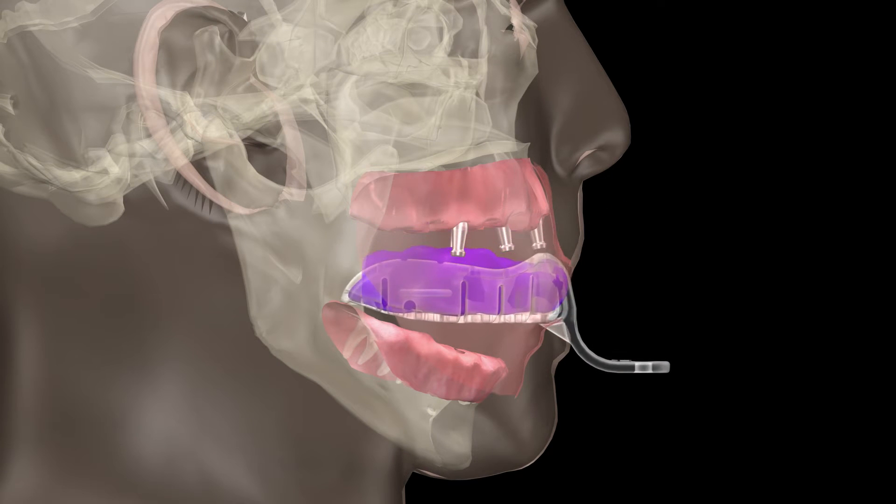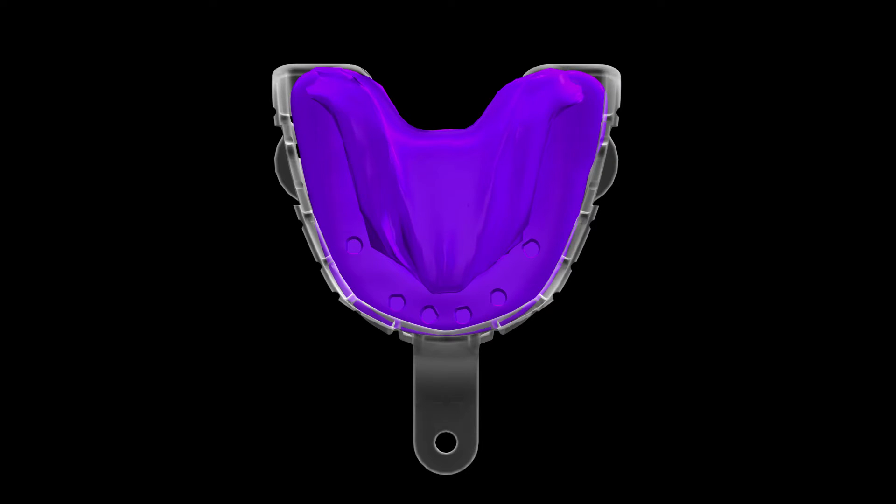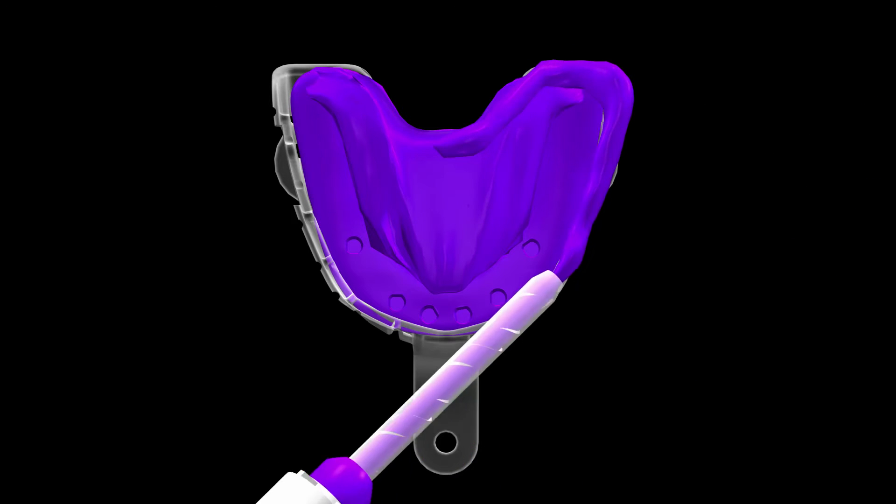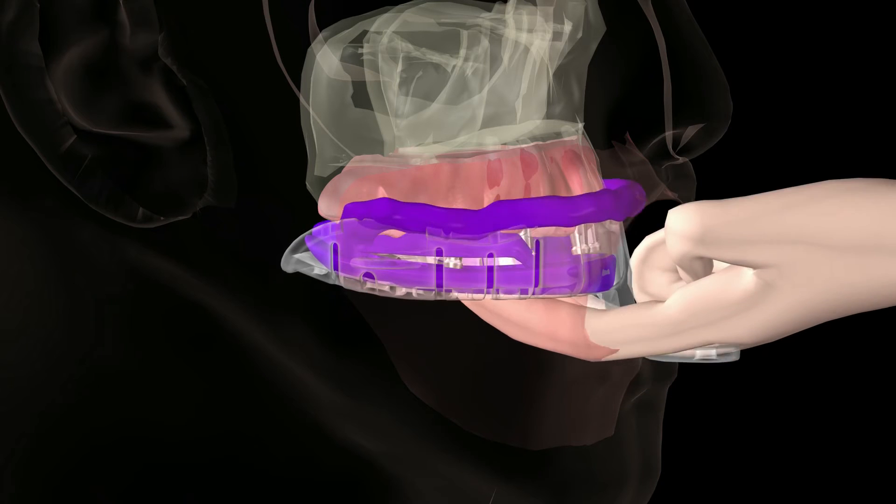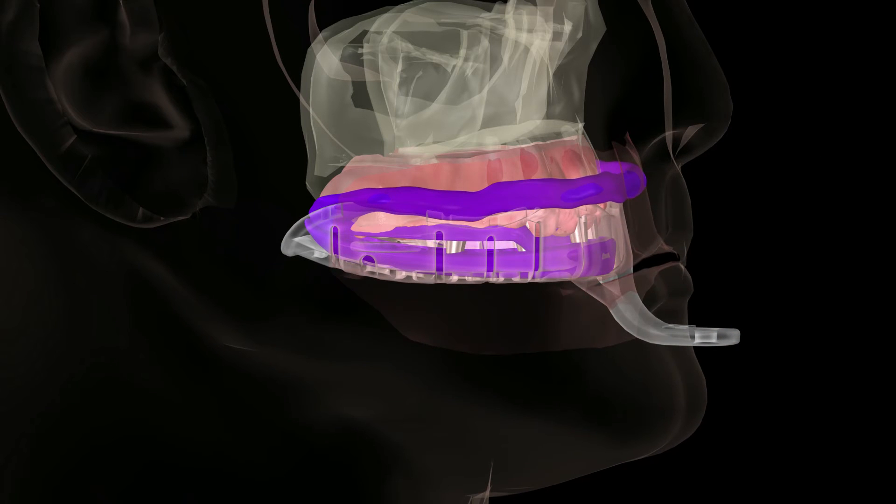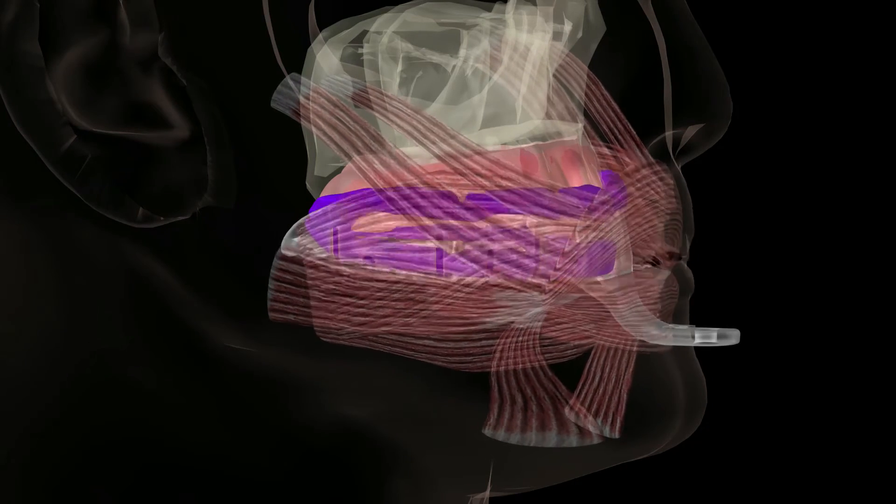Once set, remove and inspect. Remove any excess material as needed. Then, place PVS adhesive on all tray borders and apply the rigid PVS material covering all tray borders and the posterior of the tray to capture necessary peripheral anatomy. Have patient move facial muscles to obtain a functional anatomy.